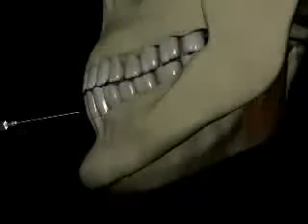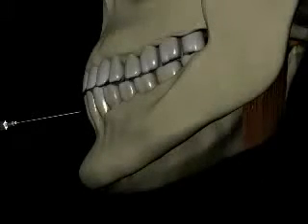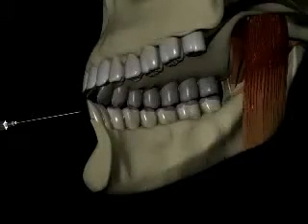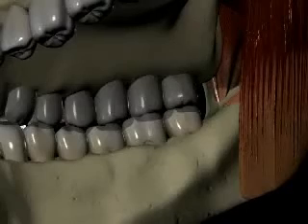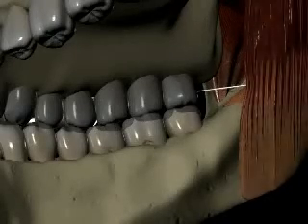No pain should be felt during needle insertion. If pain is felt, it is likely due to penetration into muscle, such as the insertion of the temporalis onto the coronoid process on the lateral, or due to the medial pterygoid muscle on the medial.